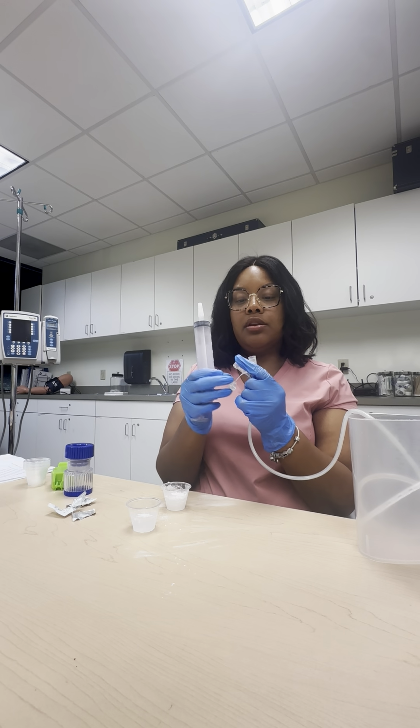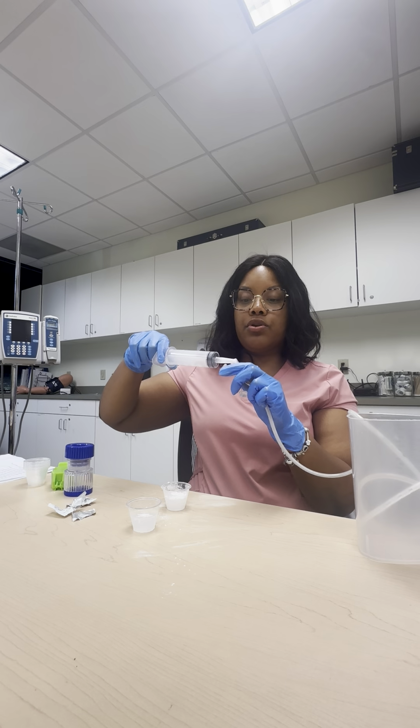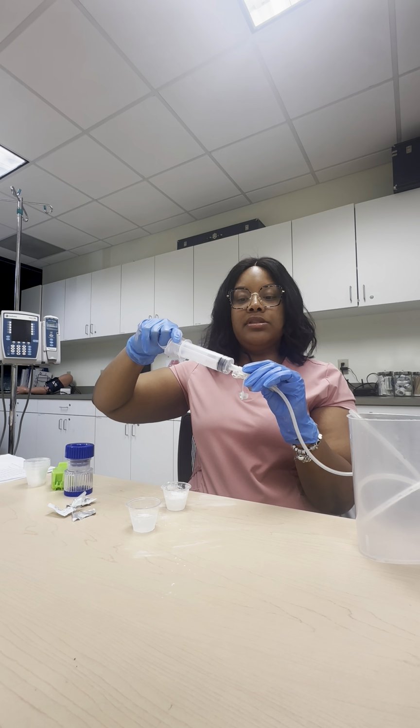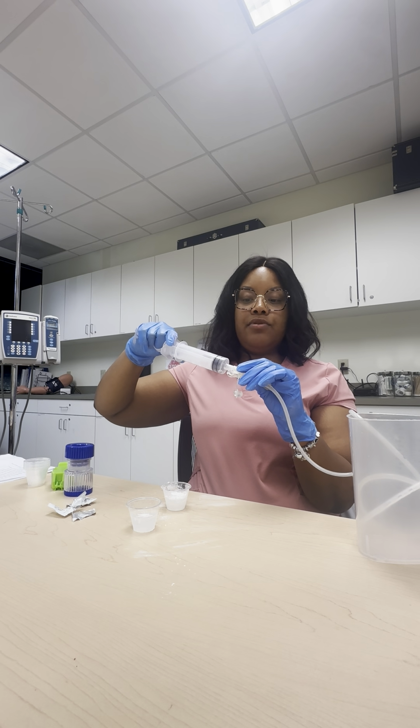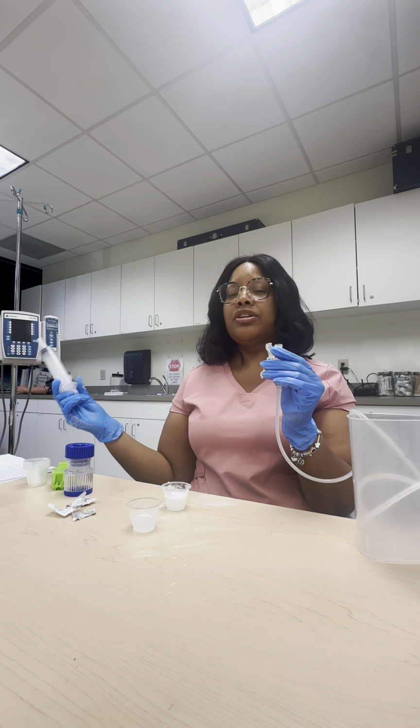So we're going to just unplug that one, and we're going to go through this port right here. In order to check their residuals, we're going to hook our syringe up here and just pull back until we meet resistance. I'm not meeting any resistance, so my patient doesn't have any residuals.